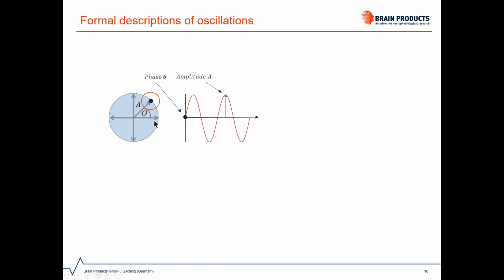And for that, we need at least two values, one for the y-coordinate and one for the x-coordinate. And here we make use of complex values that consist of two parts, a real and an imaginary part. So this type of value gives us the possibility to store two coordinates at once. One coordinate is stored as the magnitude on the imaginary axis, and the other coordinate is stored as the magnitude on the real axis, and both coordinates make up the real and imaginary part of the complex value here.